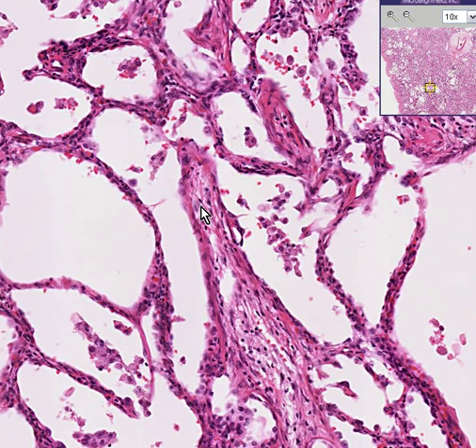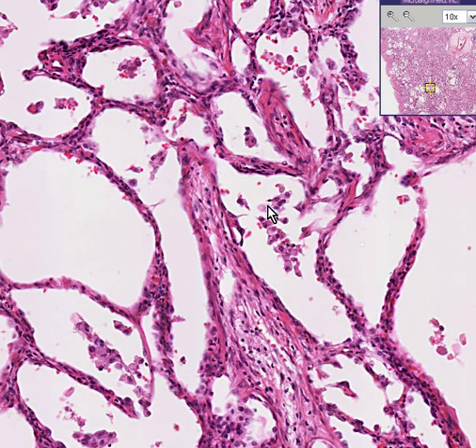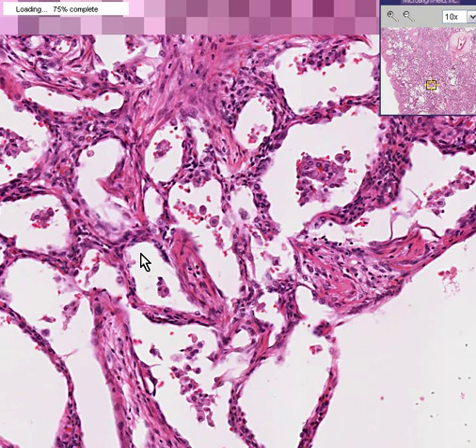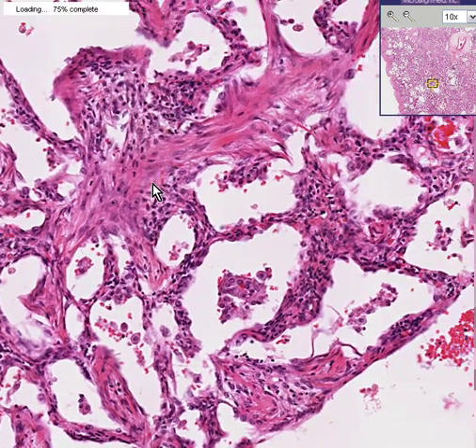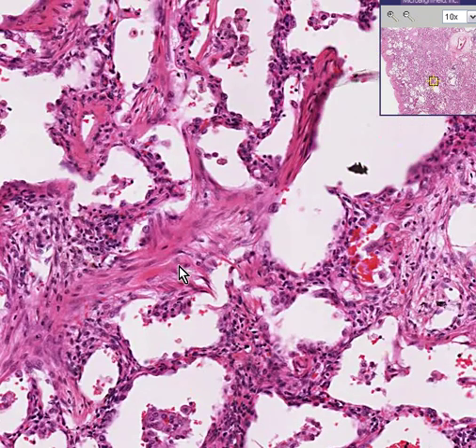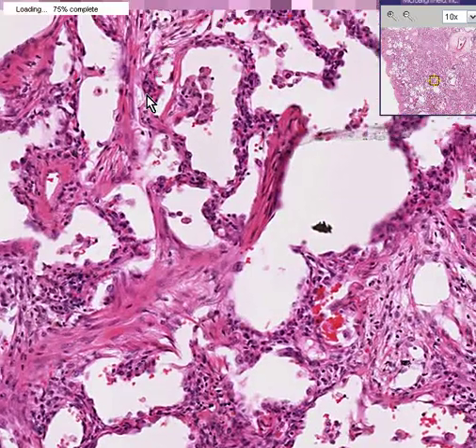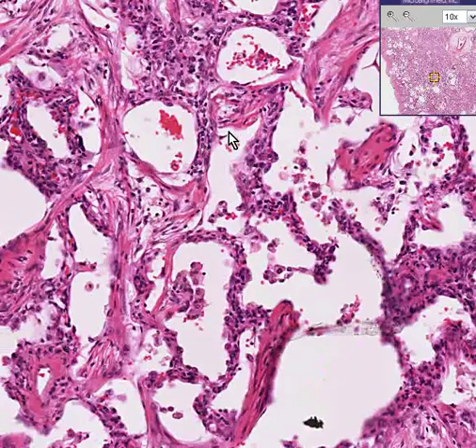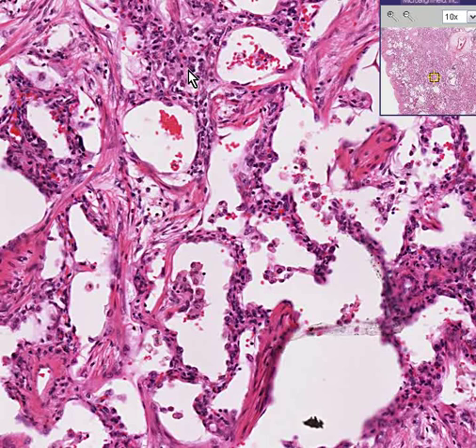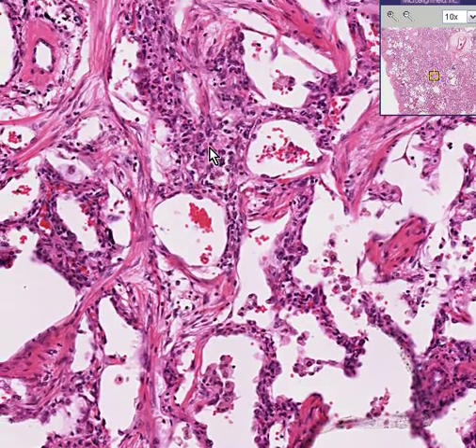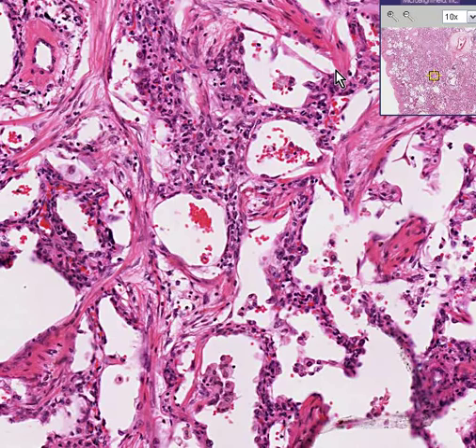It is not a specific diagnosis — it's an end-stage process due to many different etiologies. Many of the pneumonias that primarily involve the interstitium might look like this in a long-standing chronic fashion. Many of the viral pneumonias are interstitial, and many of the occupational chronic lung diseases may look like this. This is a classical interstitial fibrosis of the lung, and I thank you very much.